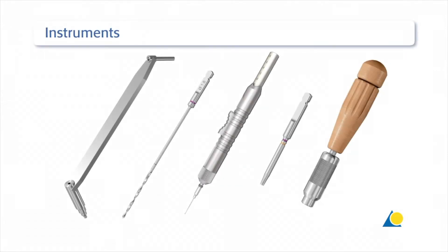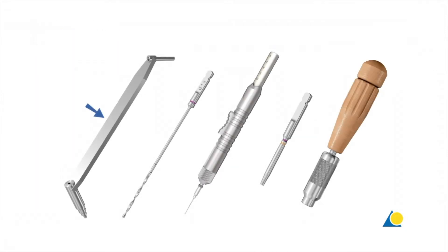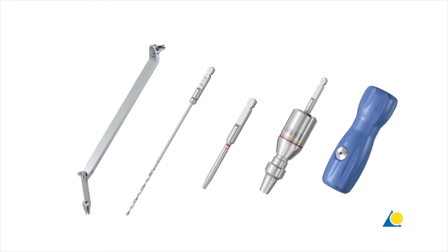The instruments needed to insert cortex screws are: the 2.4 universal drill guide, the 1.8mm drill bit, the depth gauge, and the short T8 star drive screwdriver shaft and handle. The instruments needed to insert locking screws are: the 2.4 universal variable angle LCP drill sleeve, the 1.8mm drill bit, the short T8 star drive screwdriver shaft, and the 0.8 Nm torque limiting attachment with handle.